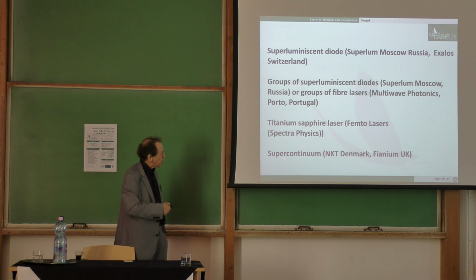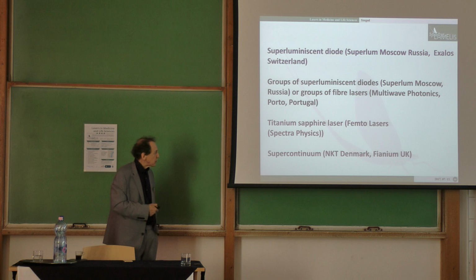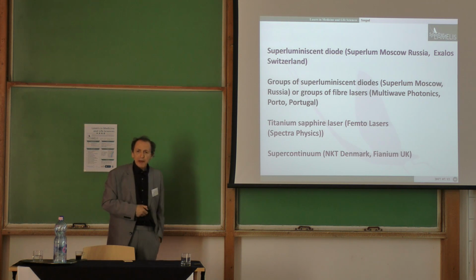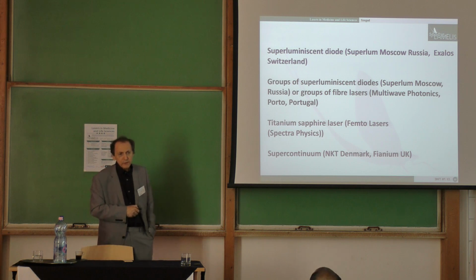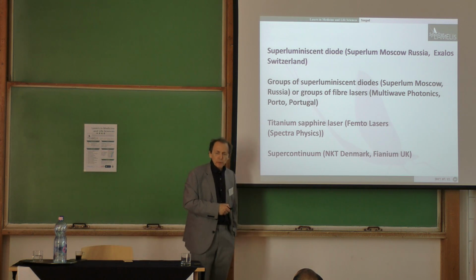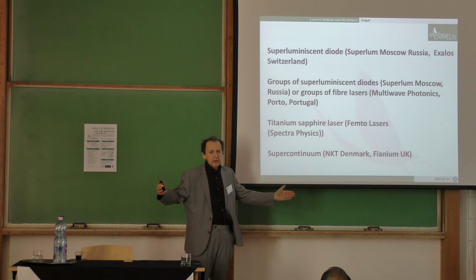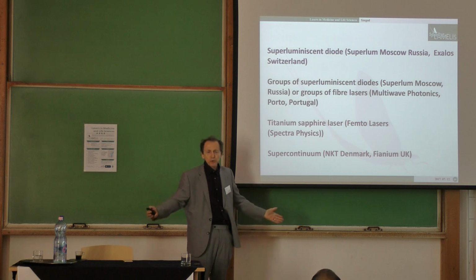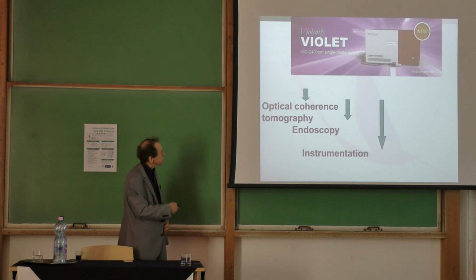And the most modern one is this, coming from these companies, which they use something which is not going to be done by any of the 3 ELI centers. No, none of the centers will do the supercontinuum. But it's another type of lasers. If you want to know about lasers, you should also read about supercontinuum. Supercontinuum is you take a femtosecond pulse, you send it to a nonlinear fiber, and you obtain all sorts of nonlinear phenomena in fiber and generate a supercontinuum of wavelengths. This is ideally suited for OCT, for high resolution OCT. And that's the source from NKT Denmark.